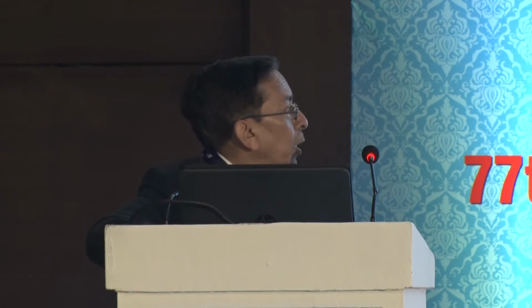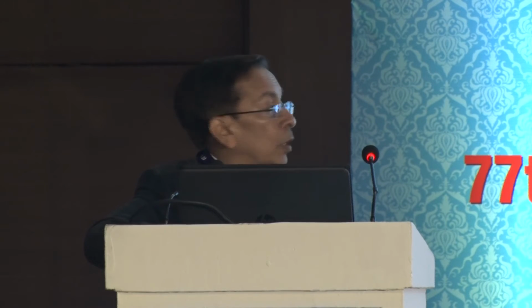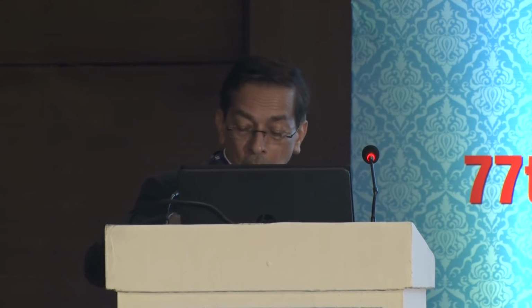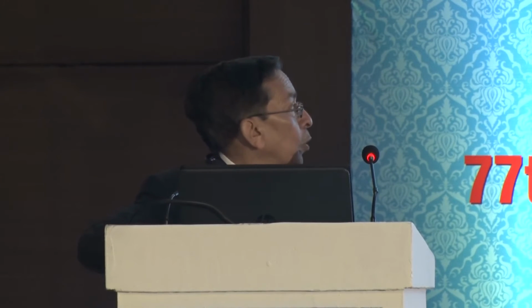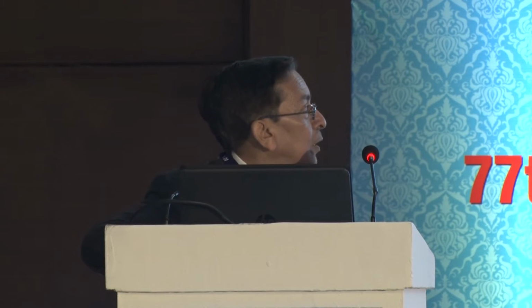iTrace shows the blurred image. At 1 mm, there is no refractive error or aberration in the internal or lens range, cornea, total aberration. But as the pupil diameter increases, the aberration increases. You can see that at 4 mm, the total aberration is increased, with 2.25 cylinder. And it was a monofocal lens.